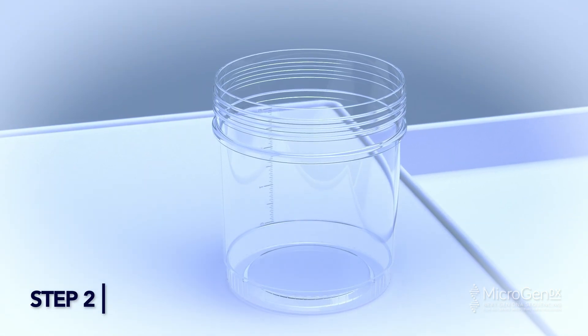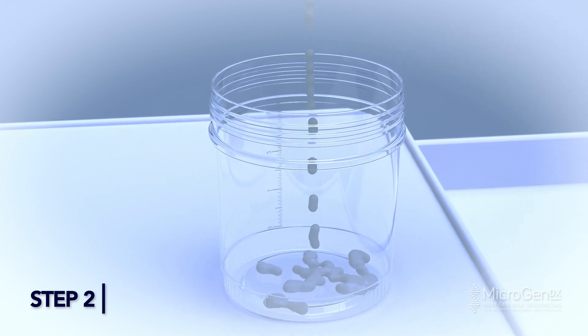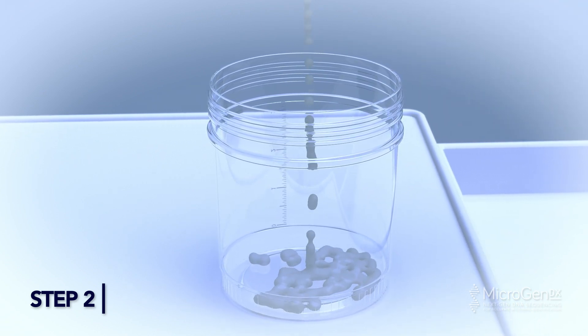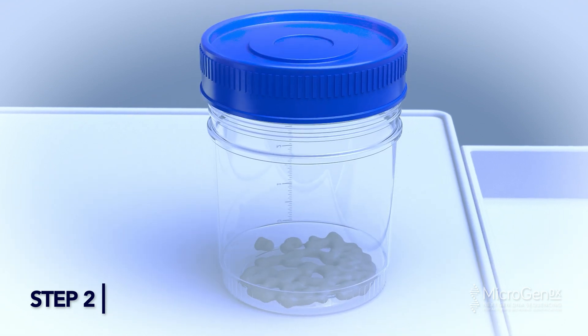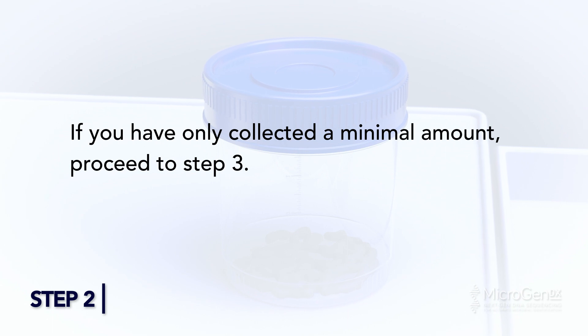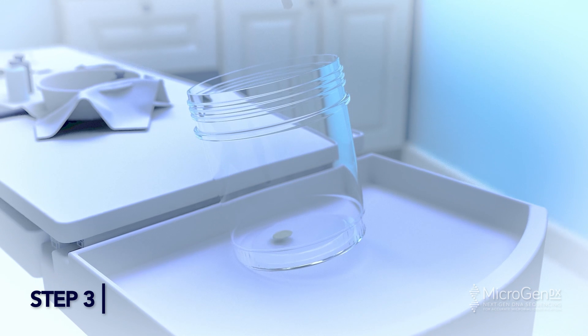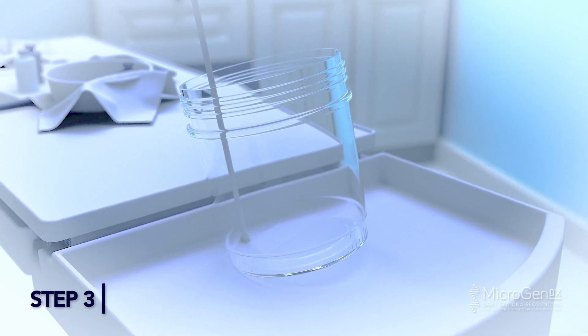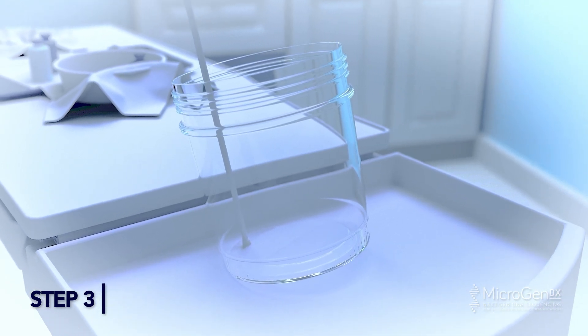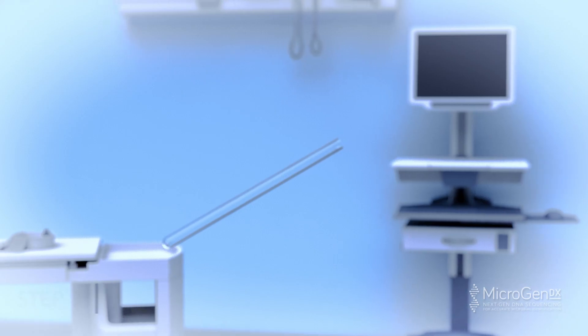Step 2: Collect semen excretion into a sterile container. If enough excretion is collected — more than a pea-sized amount — cap and seal the container and prepare for shipping. If you have only collected a minimal amount, proceed to Step 3. Step 3: If only a minimal amount of semen excretion is collected, use the swab to collect the fluid by rolling the swab through the fluid in the collection cup, collecting as much fluid as possible on the swab tip.